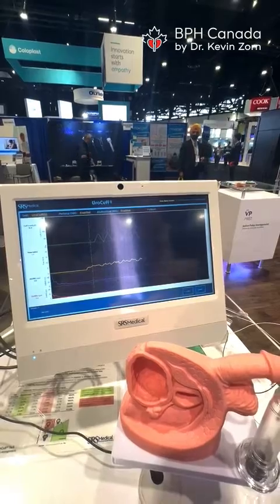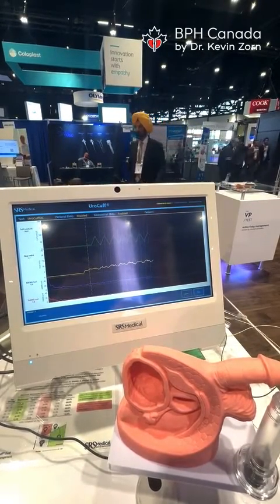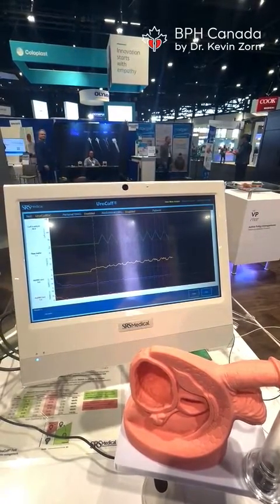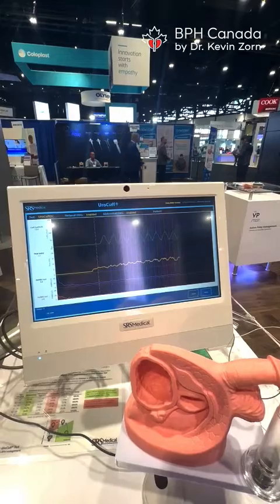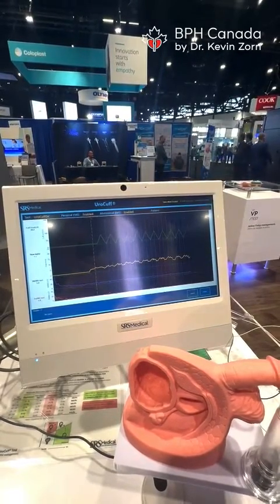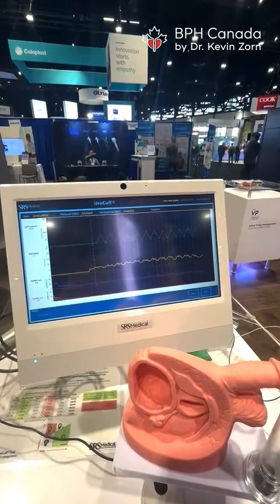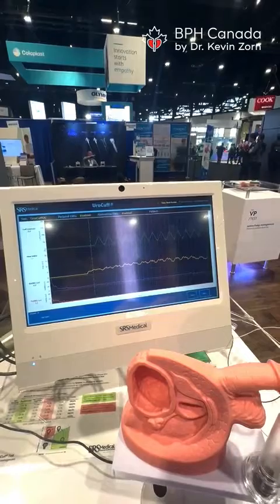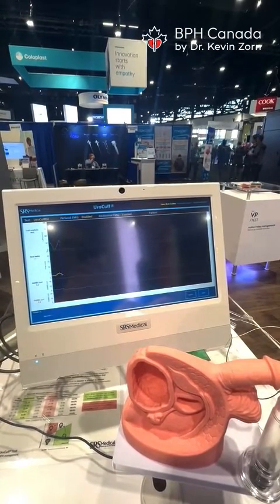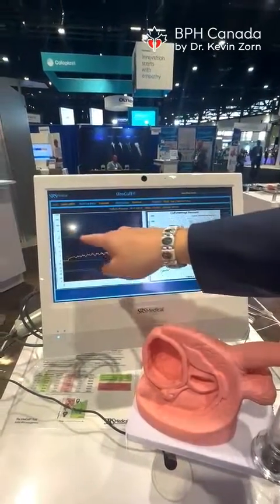And what that's going to do is allow the computer to generate an indirect measure of the contractility, the force of the bladder. We call that PDET, the pressure of the detrusor, which will allow us to know: is the bladder working harder to generate the same flow, or are we getting worse in BPH and the bladder is becoming weaker? This will help us judge when we should maybe move to a different therapy outside of medications to prevent urinary retention.